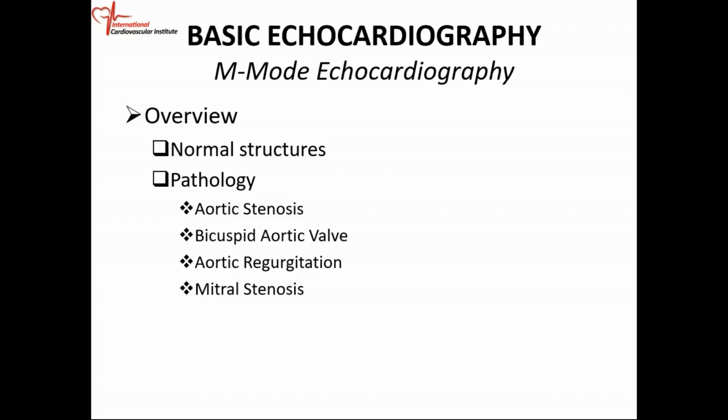When echo was first conceived of, and you did your scanning, you didn't get your two-dimensional images as you get today. You used to get these still frame images, and you get a lot of information from them. So we're going to go backwards now. We're going to learn it.